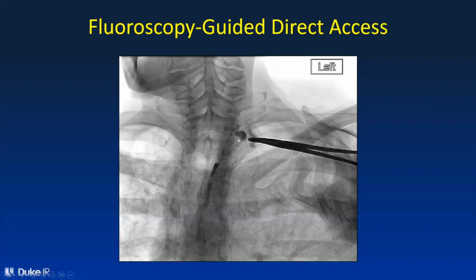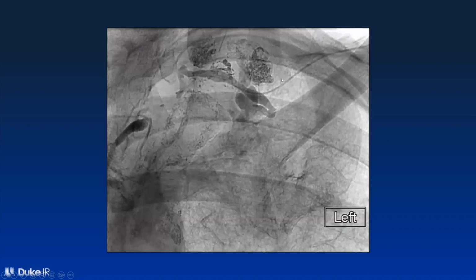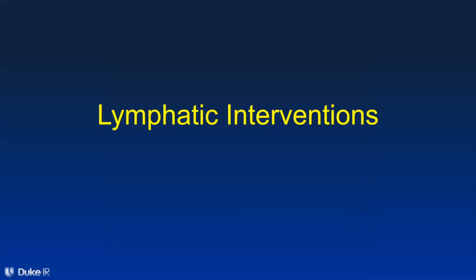So to do it under fluoroscopic guidance, you have to do the lymphangiogram, either the pedal or direct intranodal lymphangiogram, in order to inject the dye and opacify the thoracic duct first, and then be able to target that cervical portion of the thoracic duct here and access it directly without going through the vein and bypassing those terminal valves. So you access it directly through the neck, and then you catheterize it backwards. And here is the microcatheter going backwards into the thoracic duct.